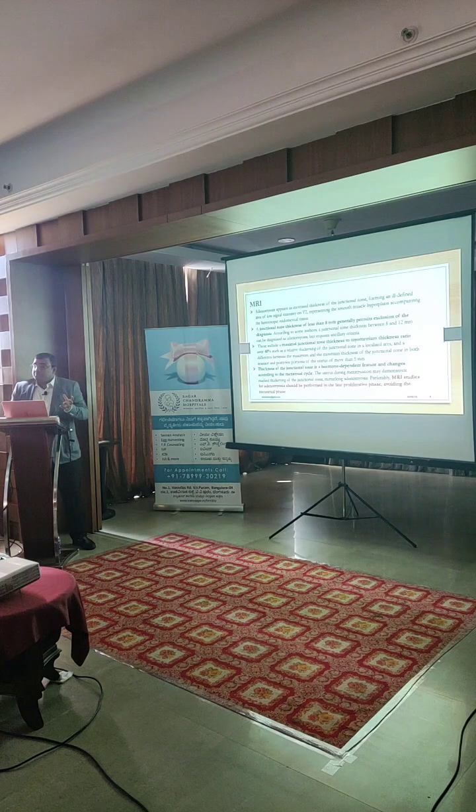MRI gives a much better picture, as I can go back and read the images 10 times, which gives me more information. I have multiple slices. If I get T1 fat sat images, even superficial endometriosis lesions can be picked up. There are very few people who can do a very good reporting of an MRI. That is the problem. When the reporting of the MRI on which you want to operate is poor, your surgical preparation is poor, so the outcome of surgery is also poor. If you want a very good outcome, your evaluation should be extra thorough.